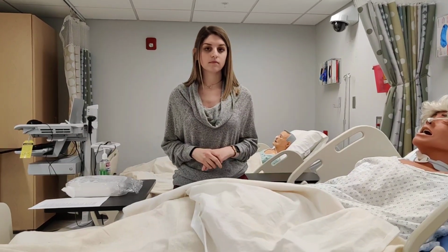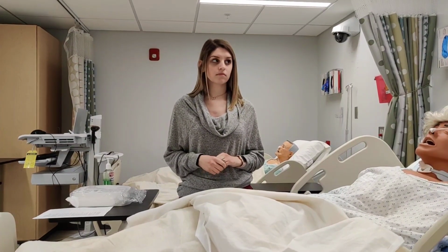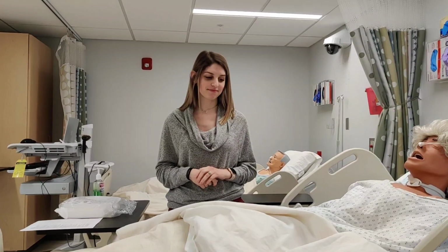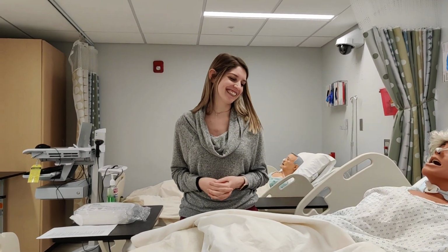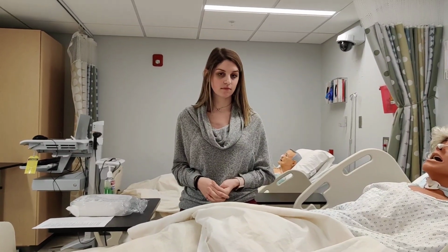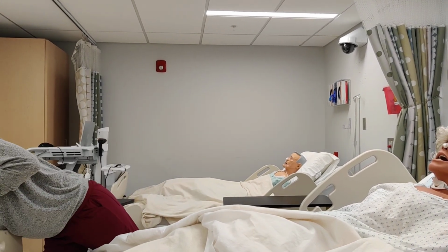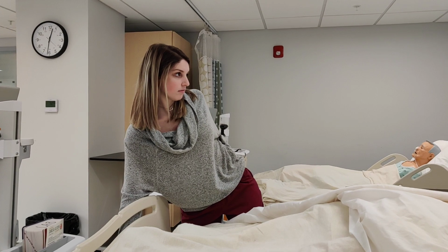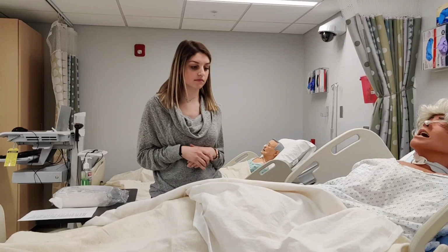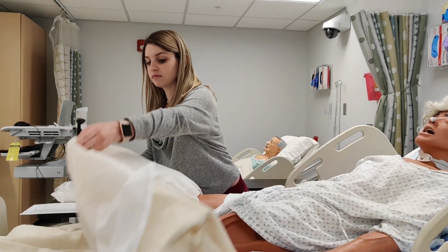When placing a catheter, we also want to ensure that we're providing privacy for our patient. So we would close the curtain to do that. We're not doing that here today, so that we can videotape this for you. So we would close the curtain to provide for privacy and raise the bed up to a good working height. Remember, we're saving our backs here. All right, once the bed is at a good height, we're going to expose our patient.